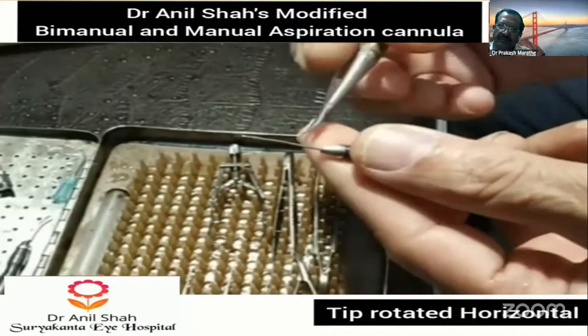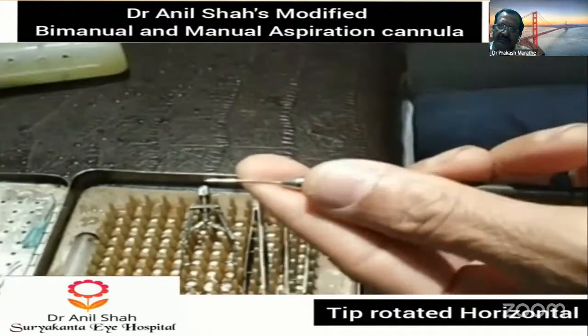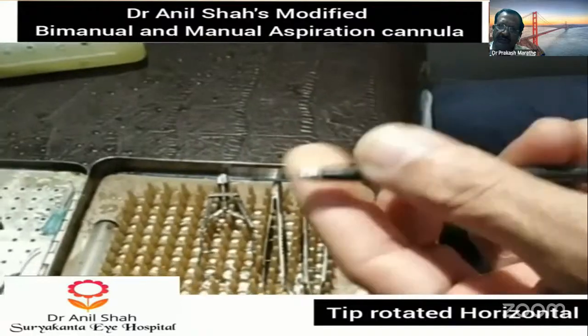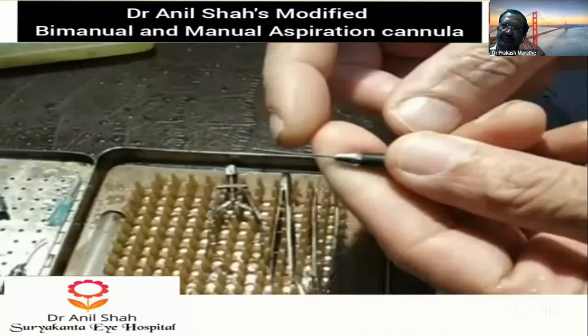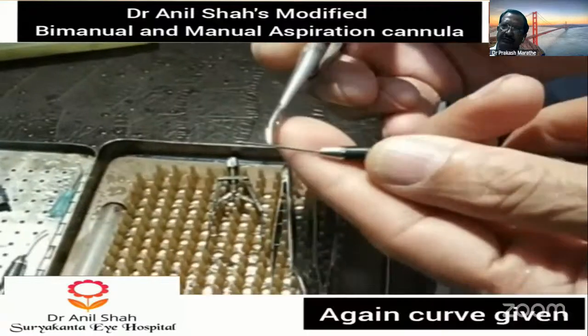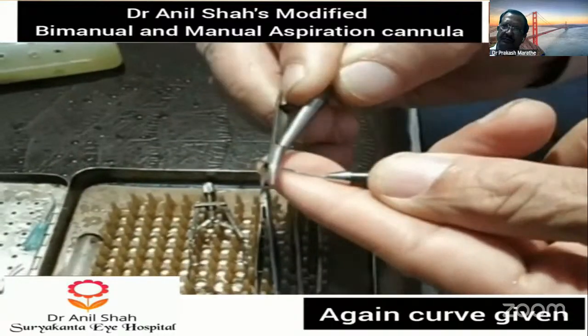Now the tip is rotated horizontally. The flow of fluid is directed horizontally. Now the same cannula is again given the same original curve.